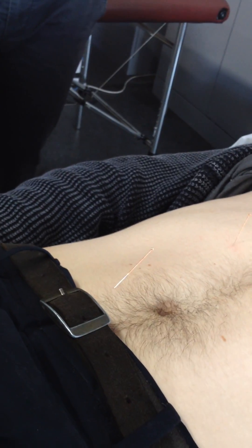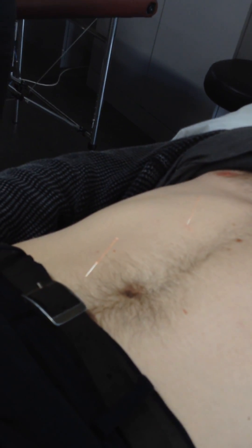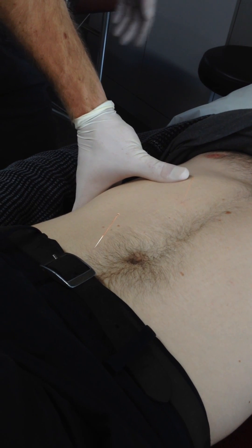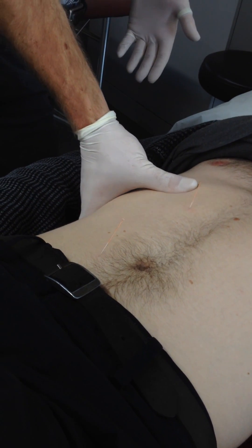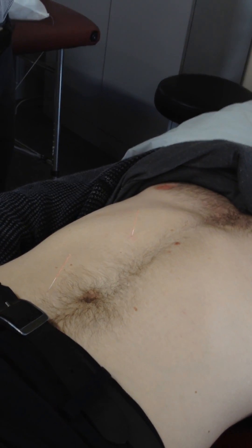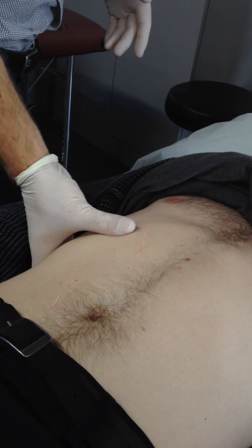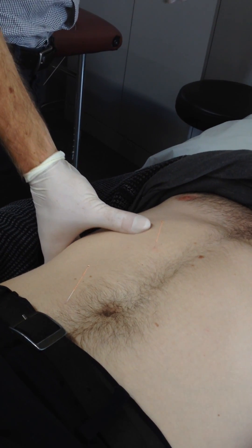Something that works really well to settle things down with this type of technique is that if you are using a more superficial approach, you can do a little bit of gentle movement, or some gentle movement through the fascia. So the needle tip sitting right on the external fascia of that muscle — that really innervated area — you can still create some stimulation with the needle tip.